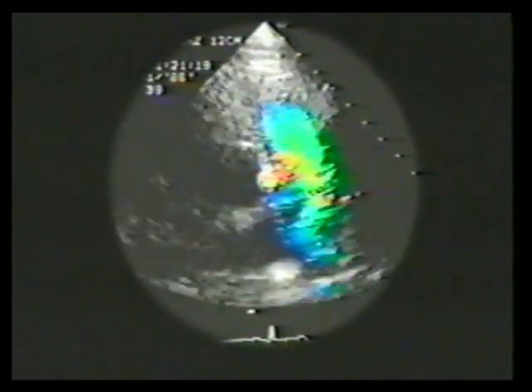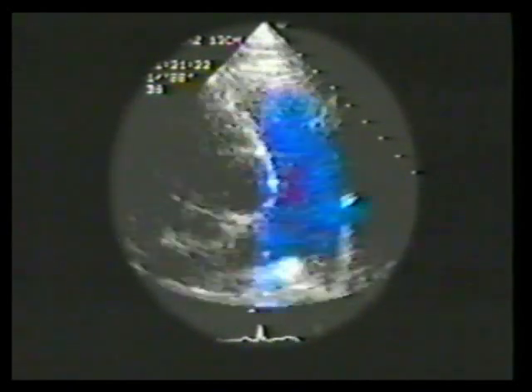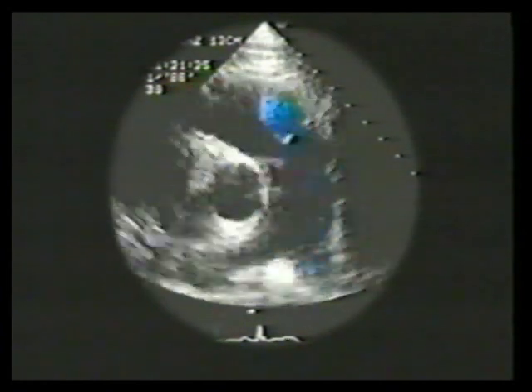As with tricuspid regurgitation, pulmonary regurgitation can be identified in the majority of normal individuals. This study is from a healthy 15-year-old male. Mild pulmonary regurgitation has a characteristic candle flame appearance in the right ventricular outflow tract. Frequently, part of the regurgitant jet originates near the base of the valve cusp. If the pulmonary valve appears normal on 2D exam, and the color extent of the PR is in the trivial to mild range, we consider the regurgitation to be physiologic.